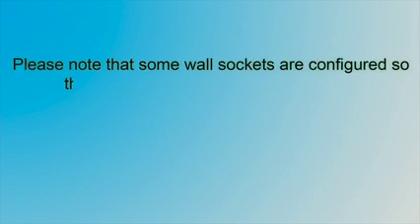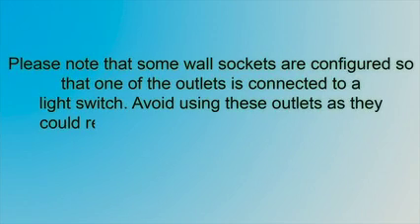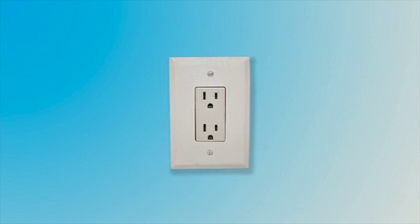Now it is time to connect the compressors to the electrical outlet. Please note that some wall sockets are configured so that one of the outlets is connected to a light switch. Avoid using these outlets as they could result in loss of airflow to your chamber. The following diagrams will describe several options for connecting your compressors to the electrical wall outlet.